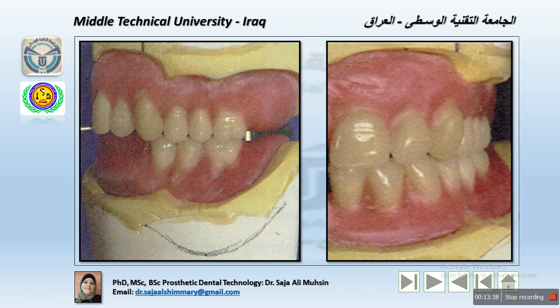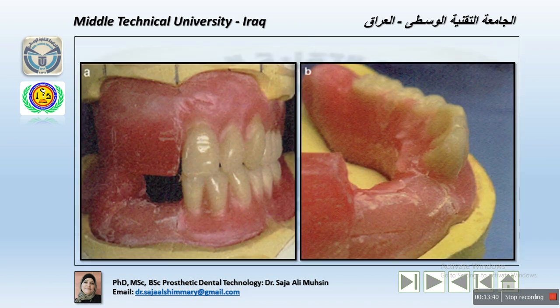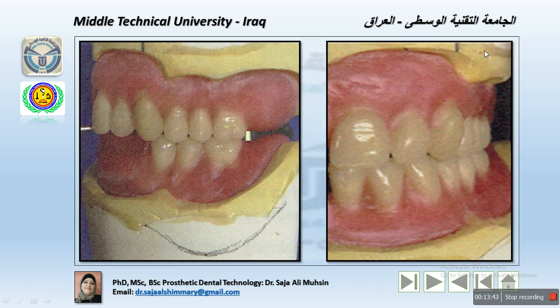This image shows the intercuspation of the molar, and particularly the first molar, the first tooth to place in the lower or mandibular artificial teeth, and then the second premolar to position in between the upper first and second premolar, and then the first premolar, which is positioned between the distal slope of the canine and the first premolar.